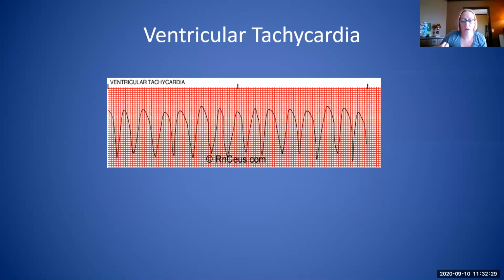So basically, cardioversion is always going to be used with a pulse. Okay, you're going to cardiovert if they're unstable with a pulse. Defibrillating then is if they have no pulse. Defibrillation is in a code situation and they have no pulse. So if in the midst of getting ready to cardiovert someone who's in VTach and they lose a pulse, you're going to switch right over to defibrillation and just shock them. And you're going to start CPR and the whole 9 yards.